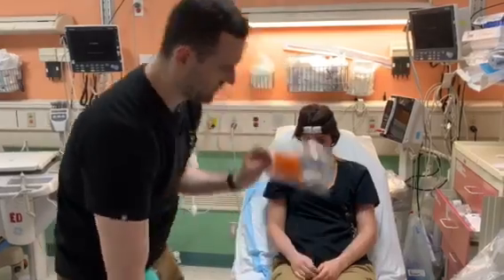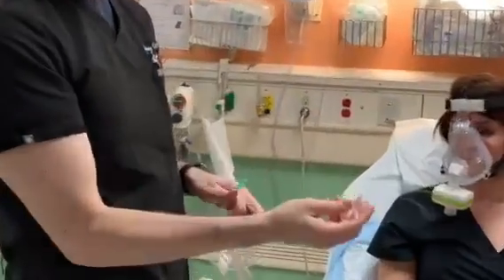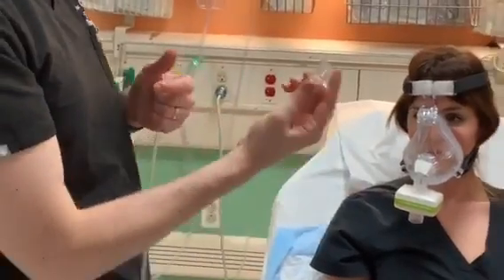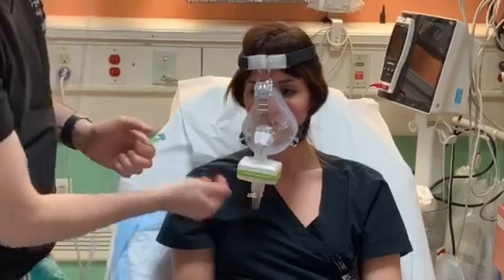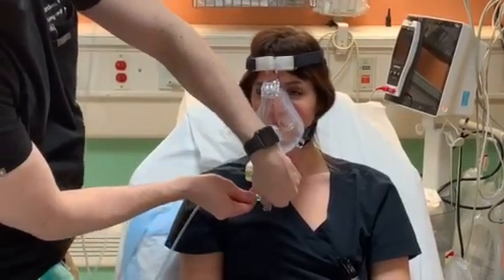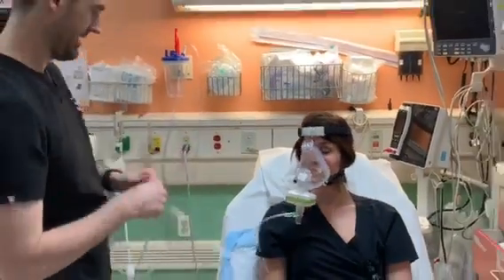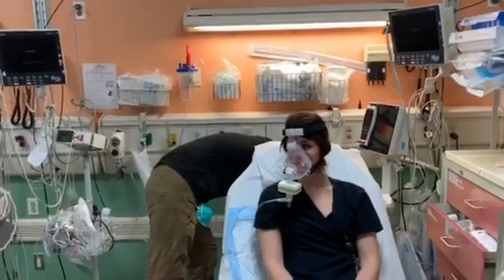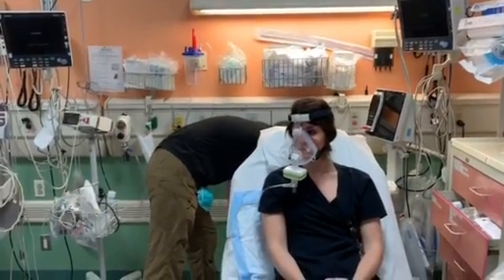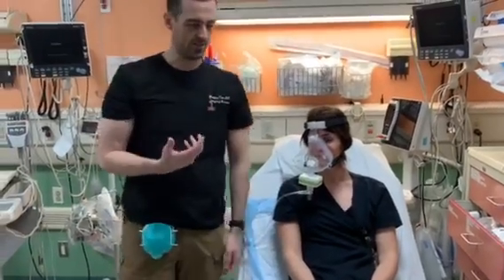The next thing we're going to put on comes in this little biohazard bag. This is a tube connector — it's going to help you connect the BVM to the mask. It only goes in one way, and you'll notice it goes in this way. There's a little side port here that we're going to hook up oxygen to. It comes with some oxygen tubing, and I suggest hooking this up to a regular oxygen tank and cranking it all the way up. This is already going to start giving her some oxygen when she breathes in.